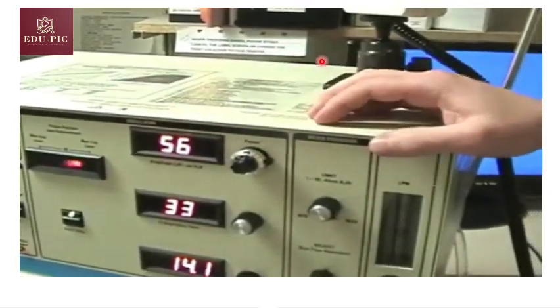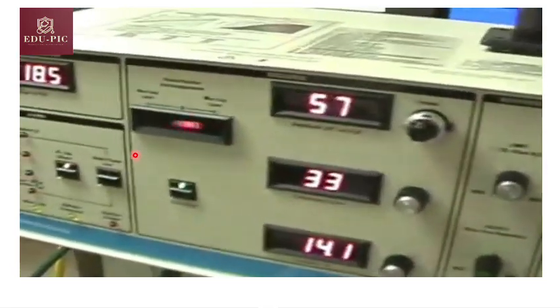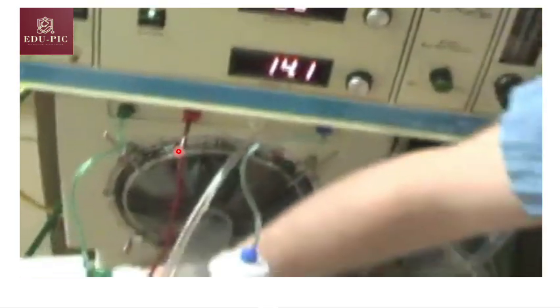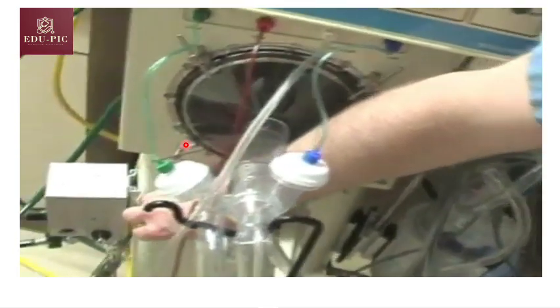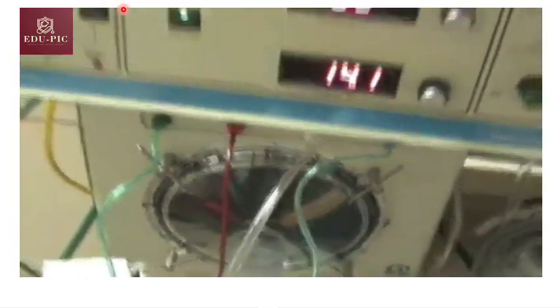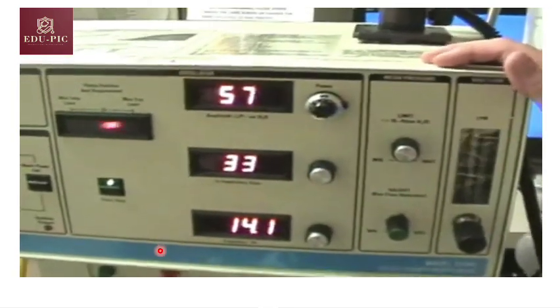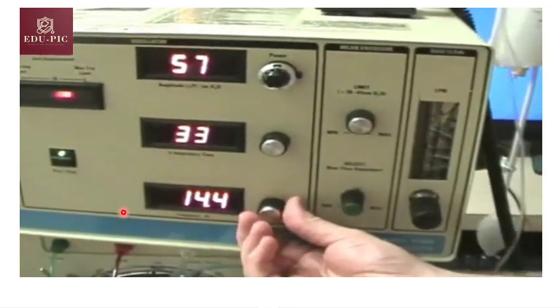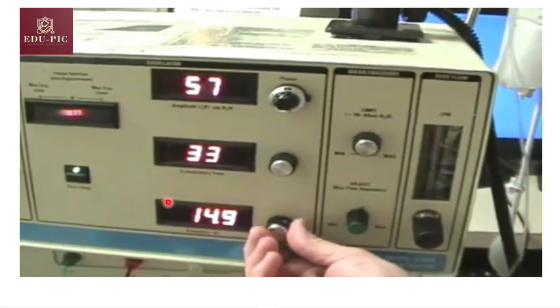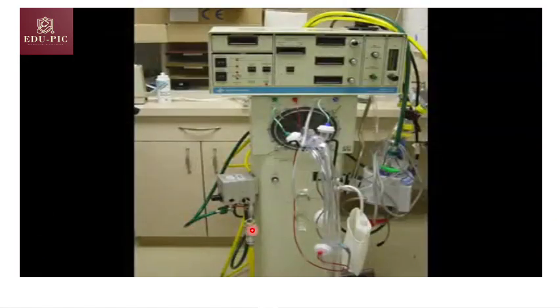As you can see, this is an amplitude or delta P of 56. It will be guided by wiggling. We will change it according to wiggling, according to CO2. This is a piston position. It should be around this midline. And this is a button for piston positioning, this one. This is a frequency. For a neonate or a preterm, we start with a 15 frequency.